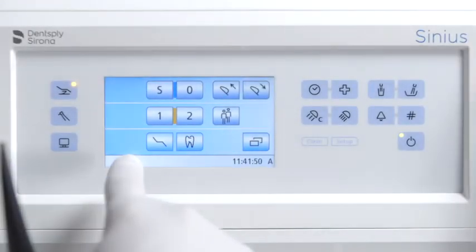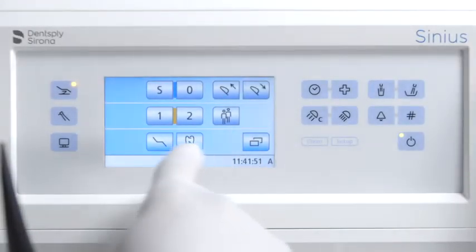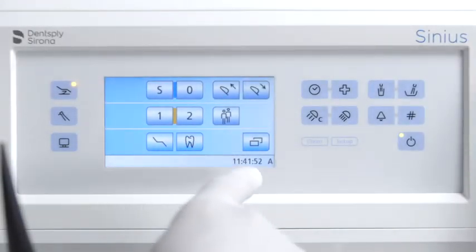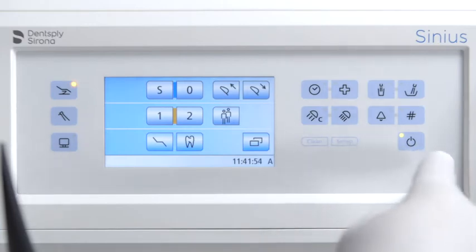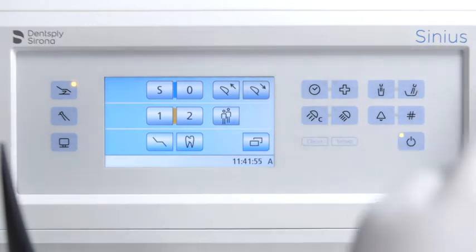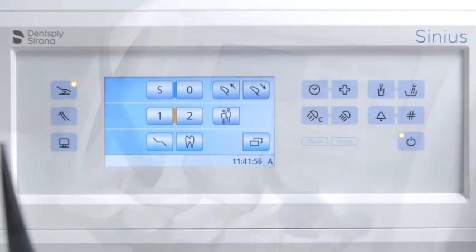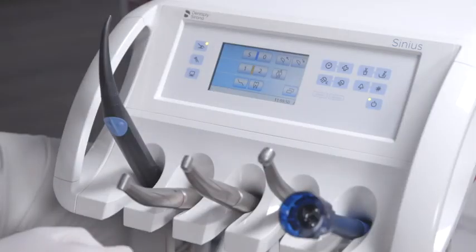The treatment center is operated via the graphical user interface and the fixed key panel. You can select one of two start screens.